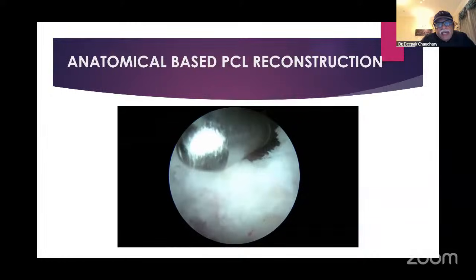Sachin, you were asking a question. Yeah, asking Milind sir regarding the posterolateral portal, because that is a little tricky. What are the precautions, any tips and tricks for the posterolateral portal? We are all very comfortable with doing the anteromedial, anterolateral, but for a PCL, we have to do a posterolateral, posteromedial portal. I think that's very, very important. Milind, any quick tips on how to get that portal in the first go? Posterolateral. Yeah, so the chronology is very important.